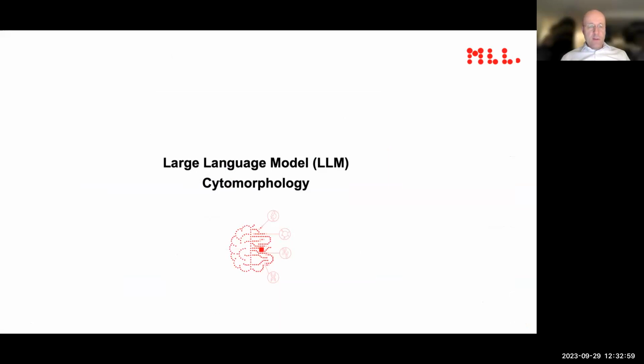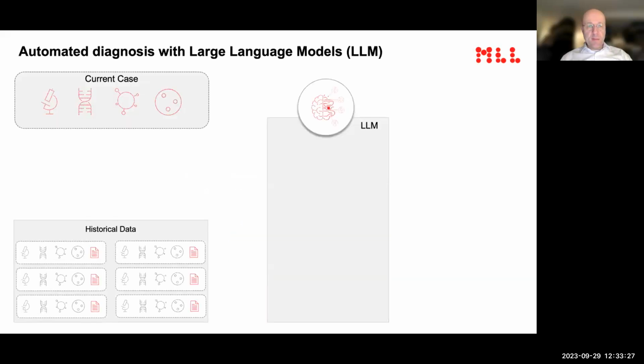We're still working on improving that, but this has allowed us, for instance, also to digitalize this workflow. At least one technician nowadays can sit at home and just review on the computer the differential, which has been automatically prepared.